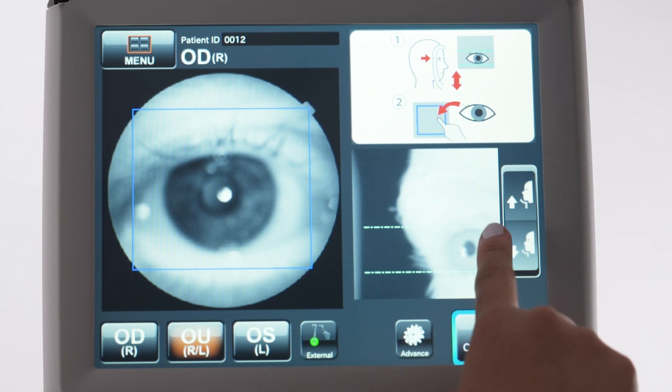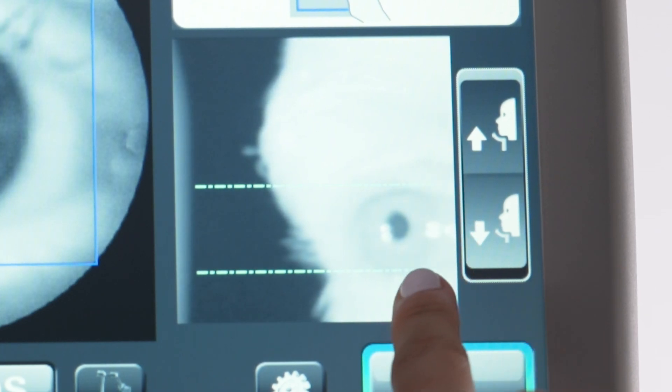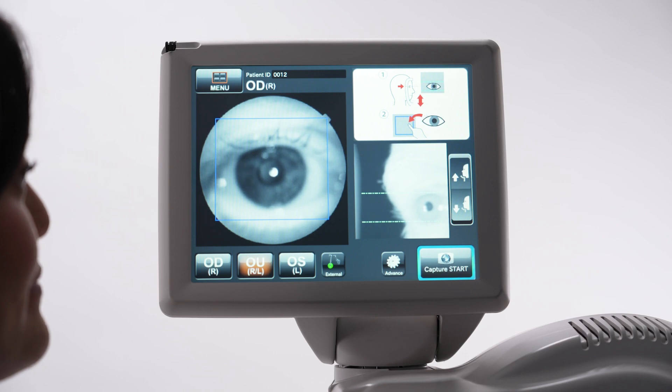The pupil should now be positioned within the two blue lines. If not, make small adjustments to the chin rest height to achieve this. Tap the center of the pupil to automatically align the MySure2.